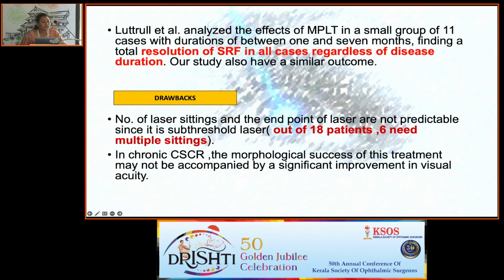And Luttrull et al. analyzed the effect of micropulse laser therapy in a small group of 11 cases with duration of between 1 to 7 months, finding a total resolution of SRF in all cases regardless of the disease duration. Our study also has a similar outcome.